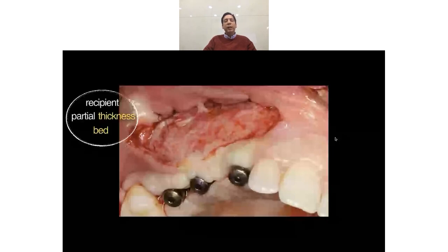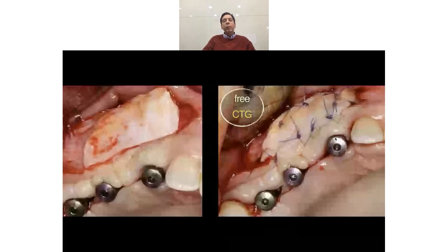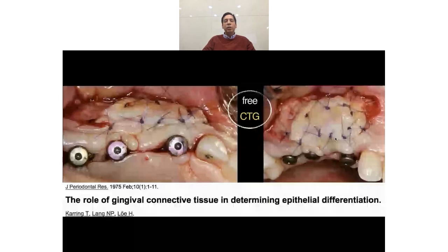And then we prepare a recipient bleeding bed, removing all the elastic fibers and the epithelium of the alveolar mucosa, and we suture that flap in the apical area. And we place the connective tissue graft with interrupted sutures in order to create a new keratinized tissue and reposition of the mucogingival line. We can see that this is not new. This was discovered by Karring, Lang, Löe, the founding fathers of the modern periodontal specialty, and some of them. And that CTG will have the power to create keratinized epithelium.